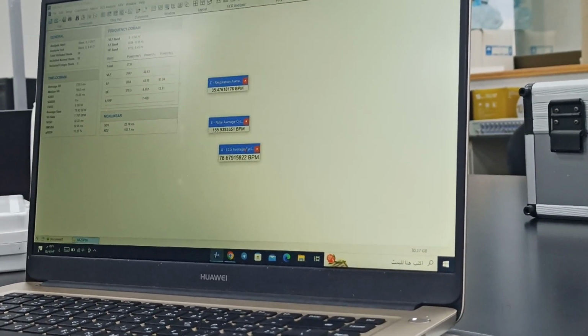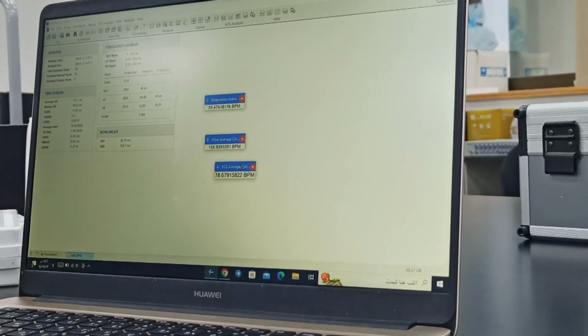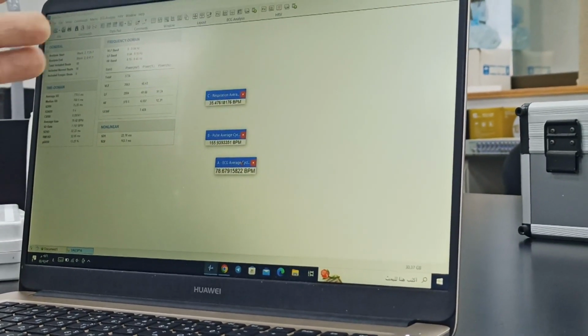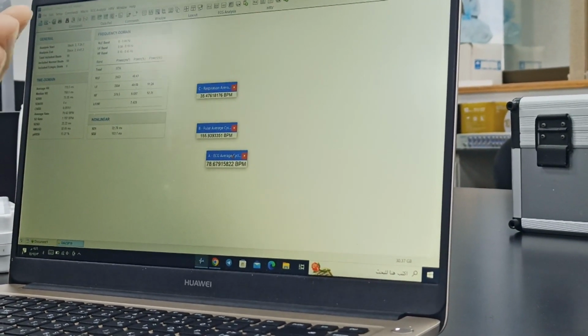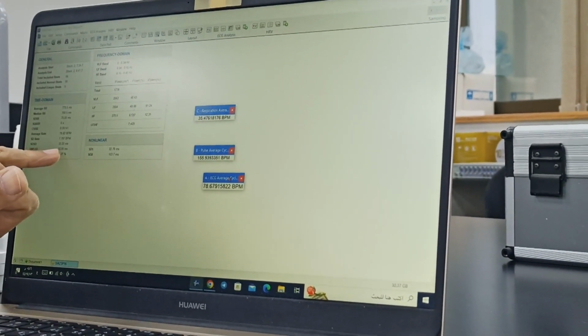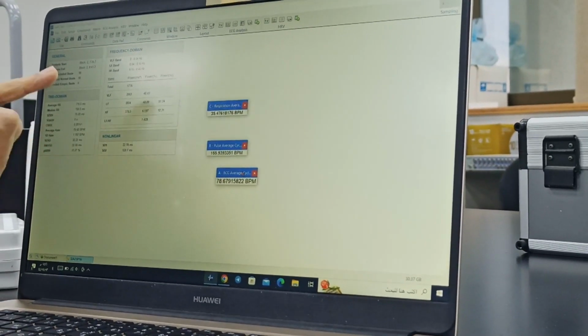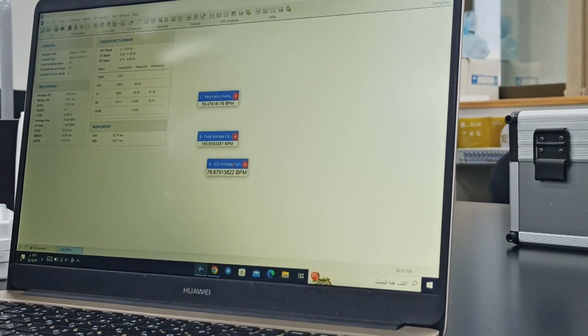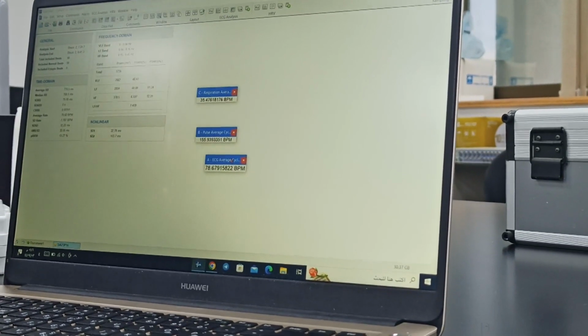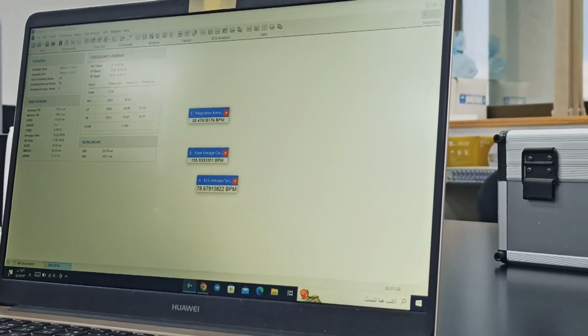The larger the RMSSD, the larger the standard deviations, the greater the PRR50, it means there is a lot of variation going on. This is a good thing. And if PRR50 is 0, RMSSD is only 10, 15, SDRR is only 10, 15, it means there are no variations going on. It is an indication that parasympathetic activity is very weak.